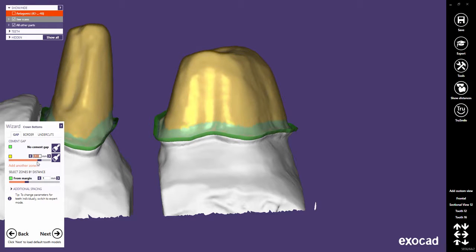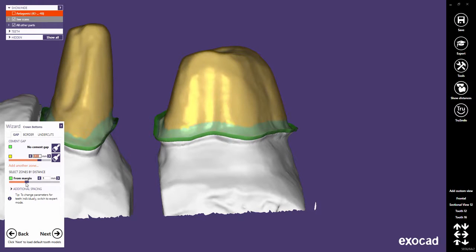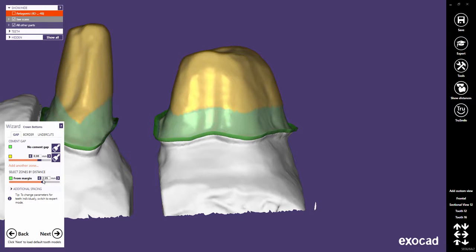The green zones on the dies and in the wizard indicate areas where there is no gap. The distance from the margin without cement gap can be adjusted with the slider from margin, or by typing in a value.